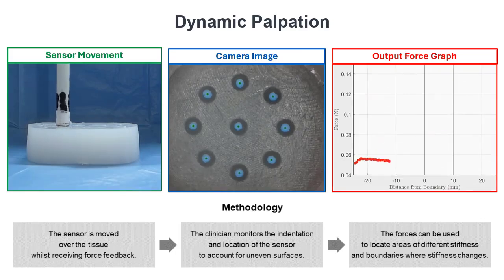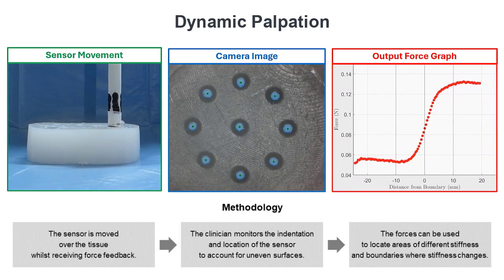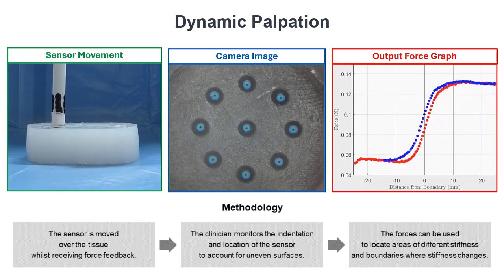On the other hand, the sensor can perform dynamic palpation when working as a force sensor. Here, the sensor is moved across the tissue. As the stiffness of the tissue increases, the force acting on the sensor increases. Our stiffness sensor is deliberately designed to be able to detect those cancer cells under the surface of the tumor.